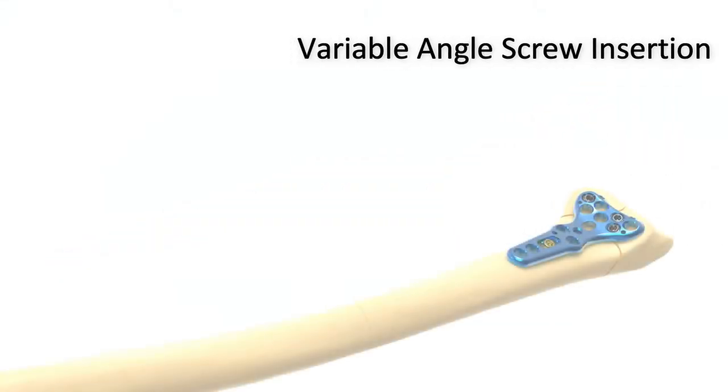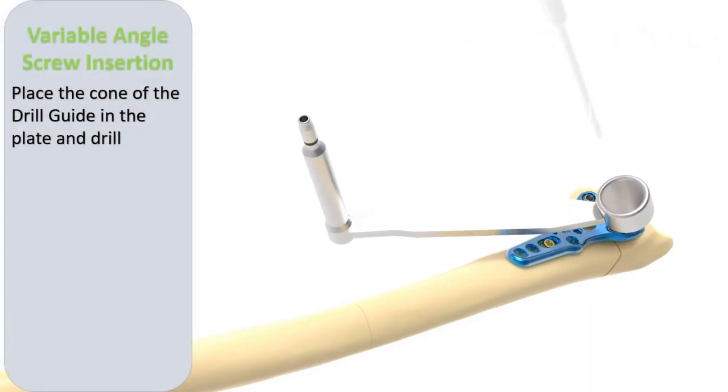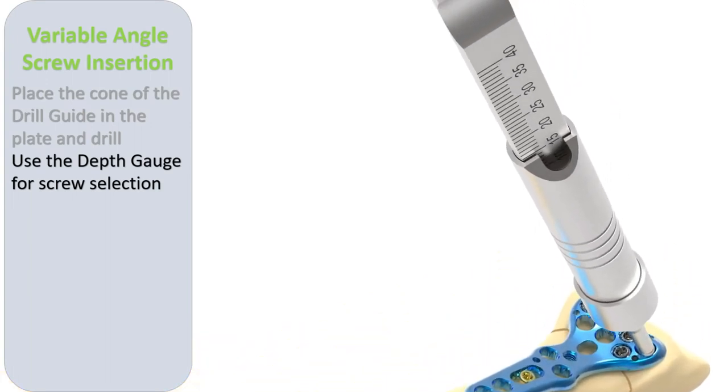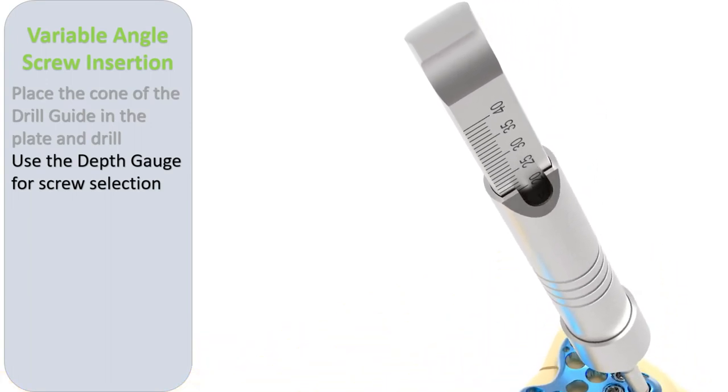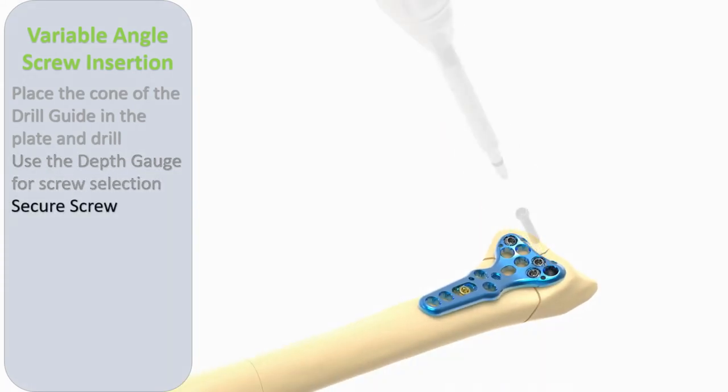Although screw alignment through the standard guide is appropriate for most fractures, the variable angle screw technology allows for adjustment of screw alignment. The VAST technology allows for a 30-degree variable angle screw placement. The cone end of the drill guide fits securely in the plate screw holes, allowing for accurate drilling within the 30-degree cone.